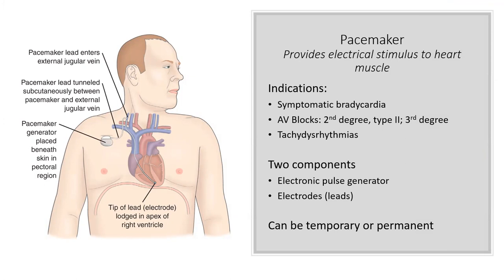The temporary ones you'll usually have after a CABG. They'll have these external pacemaker wires so they can control the heartbeat, or if they need to send a different pacing signal while the patient's trying to get that new blood flow.